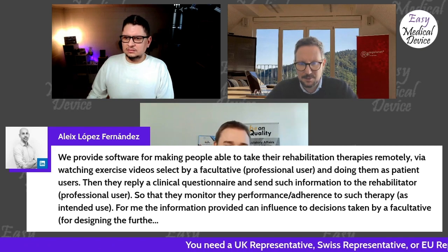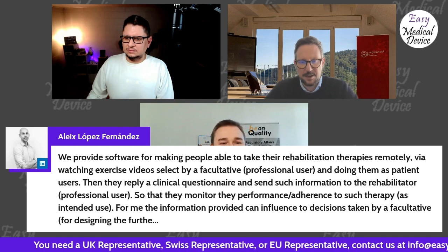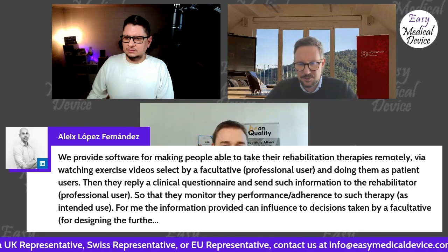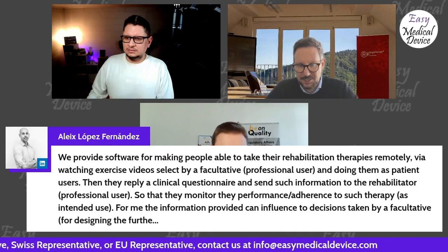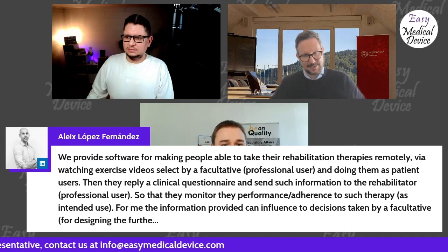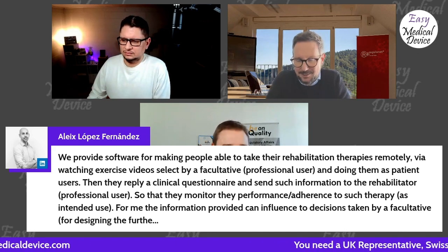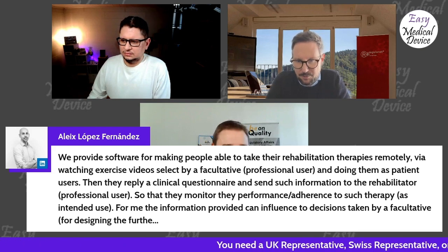The second one, clinical questionnaires. Stefan, you're exactly right. As soon as we have a questionnaire that deals with scoring and with calculations, then Stefan already mentioned the borderline manual. At least in the European framework, you are getting into the medical device framework with this kind of approach.